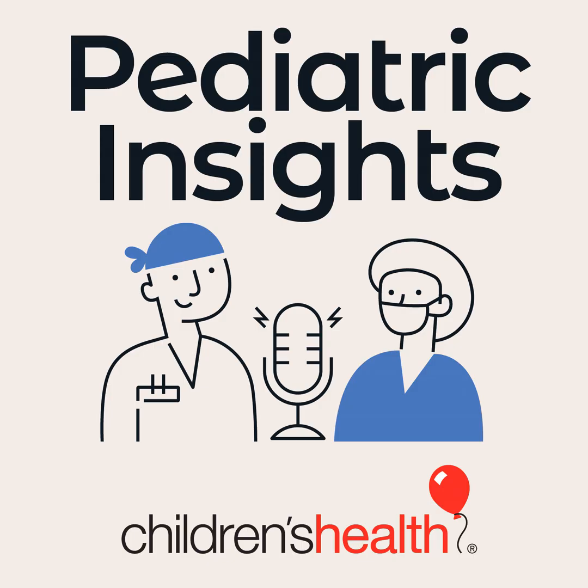For example, a neonatal heart is about the size of a strawberry, and this isn't a full-term baby. So early on in gestation, you have to go smaller and smaller. We're talking about raspberries now. So this is what we're trying to image, and we're also trying to gate this heart and assess systole, diastole, and how the heart is moving.